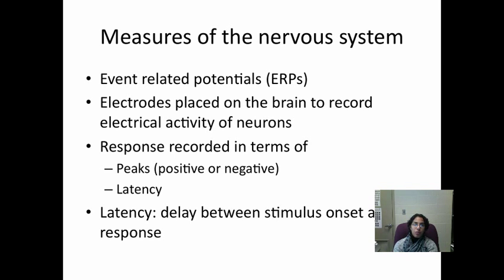So how long from when the stimulus is provided, the onset of the stimulus, to when you see a response from the brain, that is determined as latency. If I talk about event-related potential, which is electrodes placed on the head to record electrical activity of the neurons, there could be positive peak ERPs, positive peak event-related potentials. There are negative peak event-related potentials.